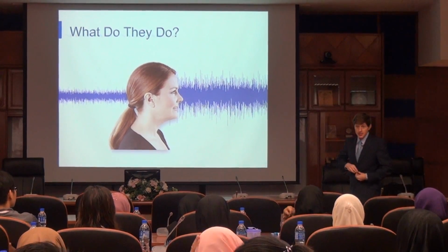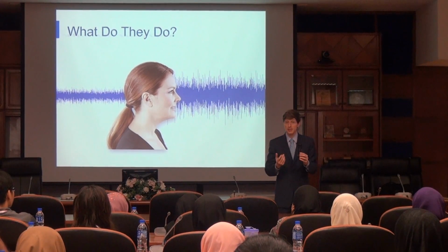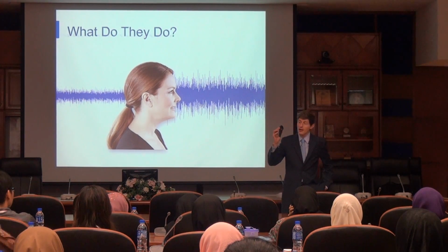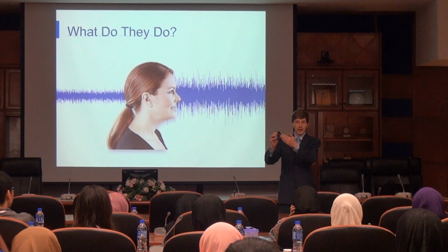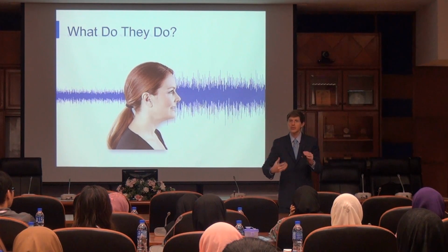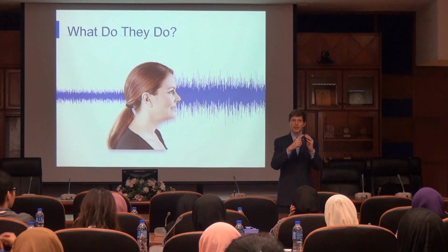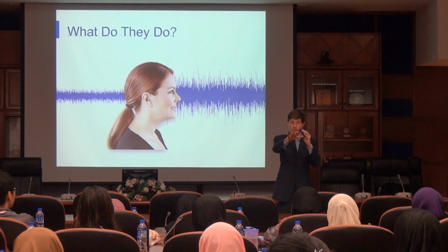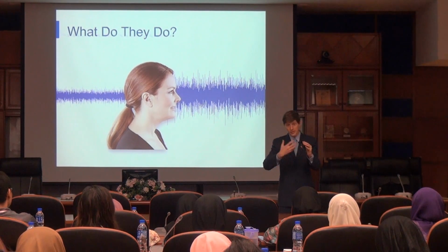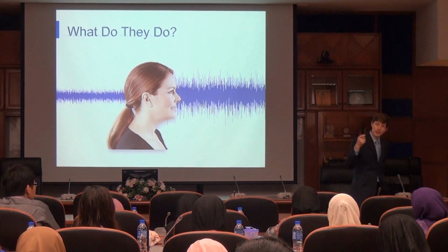The reason that happens is that these microphones are intended for performance. They're intended to be used by a singer or a band. And so this microphone most often is on a stand, and this side of the microphone is facing the audience. If you've ever been at a concert, the audience can be very loud, screaming and throwing their hands in the air. And you think, well, why don't I hear the audience through the microphone? It's because it's using a directional microphone to reduce the level of the audience and amplify the singer or the instrument without amplifying the audience. So we have an example of where directional microphones are used every day.